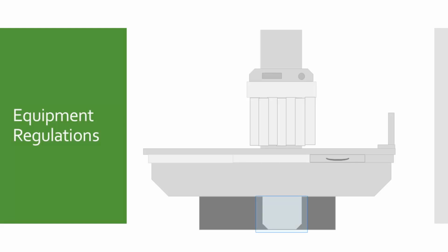The fluoroscopic X-ray tube must not be able to produce X-rays while the fluoro tower is in the park position and not aligned with the tube underneath the table. The bucky slot cover reduces radiation to the lower abdomen and gonads. It must contain at least 0.25 millimeters of lead. The fluoro lead curtain must also have the same lead thickness of 0.25 millimeters.